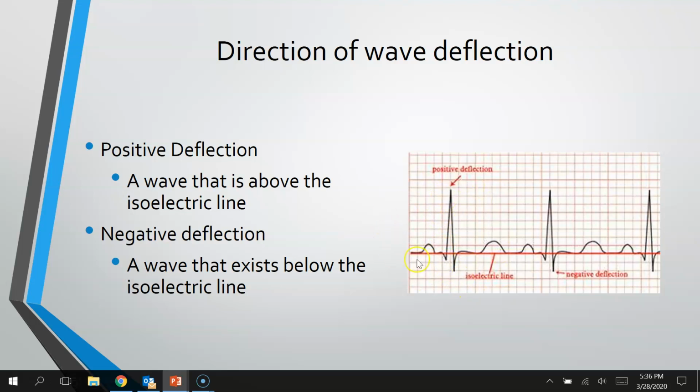Now, when we look at this on the EKG screen or on the monitor, if we do not have a positive deflection here in lead 2, we've got the leads on wrong. We've got the right leads on the left side and the left leads on the right side. So you need to double check that, switch them around. Remember, it's the patient's left and right, not your left and right.